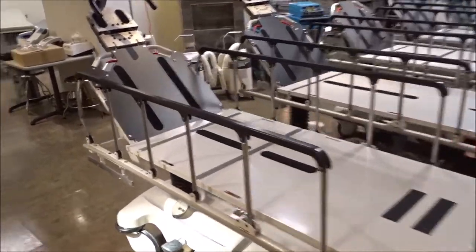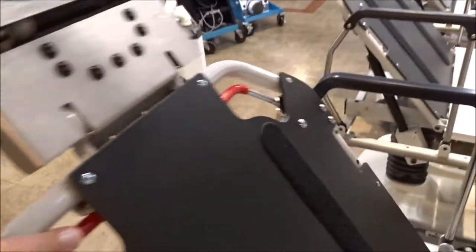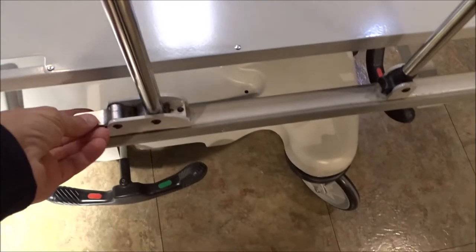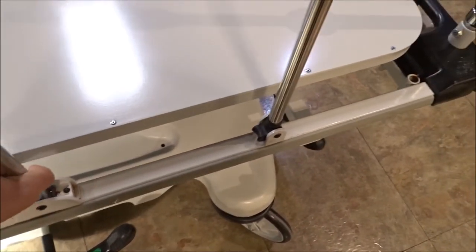You have the pneumatic back area right here — this handle you simply lift up and you can raise or lower the stretcher. And you do have the collapsible rails, so you just lift up on this and it will drop the rail down, so you can lower the rail if you wish, or you can keep it up.